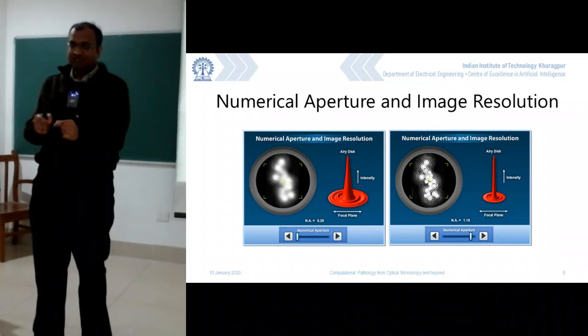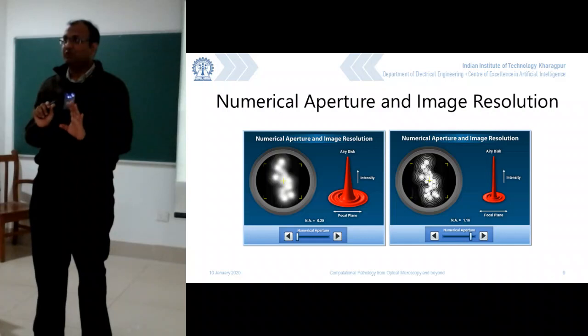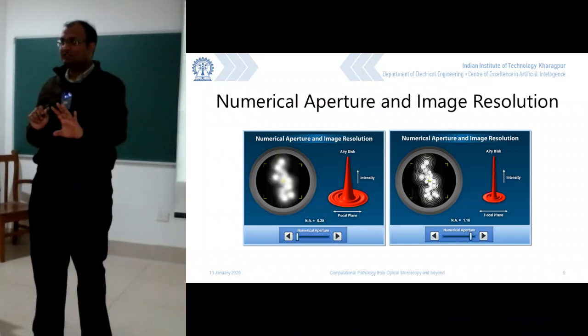Resolution is typically defined as the physical distance between 2 points in space which can be discriminated as 2 independent points. That's the simple definition of resolution.